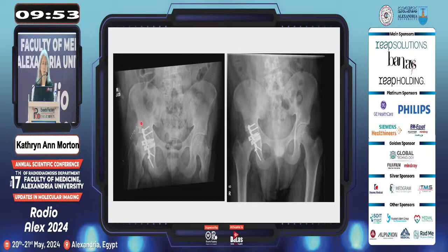This is a patient who had a pelvic reconstruction due to a comminuted acetabular fracture. This was the post-op image showing the surgical clips here. A follow-up image that was performed routinely was initially read as normal, but there were actually some funny little air connections here. I don't know whether you can see those well, which suggests that there may be more of a problem. The wound had not healed well, occasionally was draining.